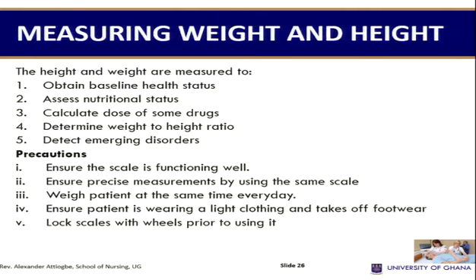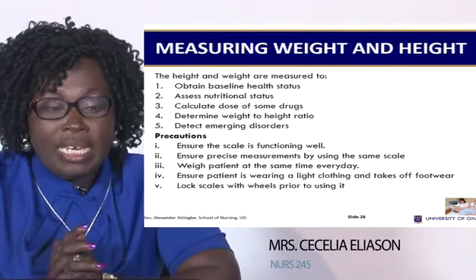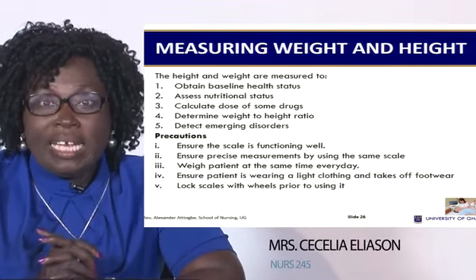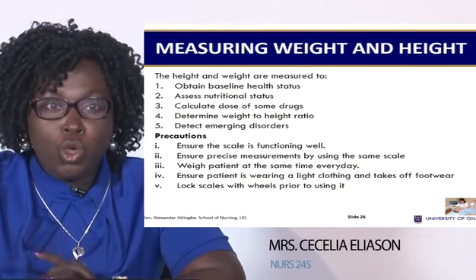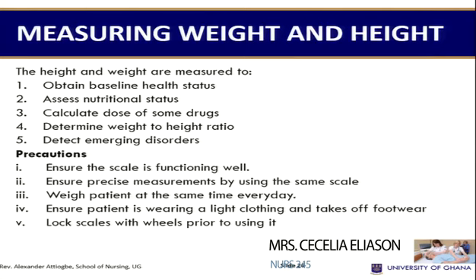So we move on to look at checking of height and weight. Measuring weight and height. The height and weight are measured to obtain baseline health status, assess nutritional status, calculate dose of some drugs, determine weight to height ratio, and then detect emerging disorders.